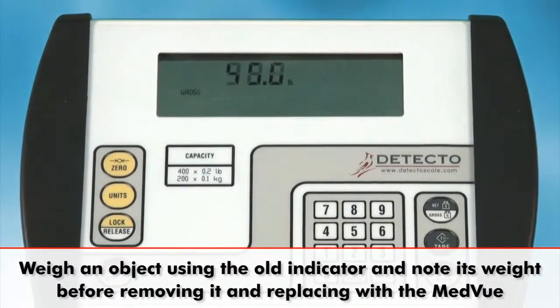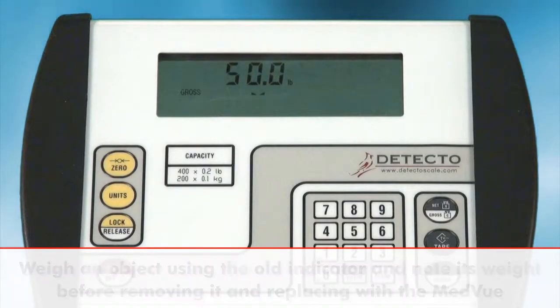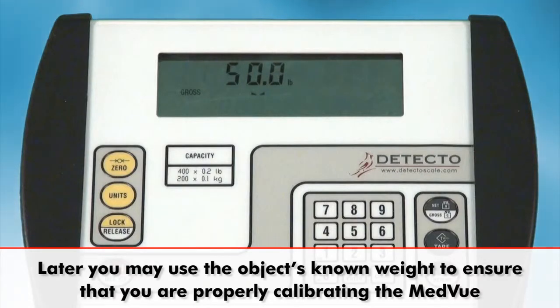a helpful hint is that you can weigh an object on the scale at this point using the old attached indicator and note its weight before removing the old indicator. Then you may later use that object's known weight to test the new MedVue's calibration.